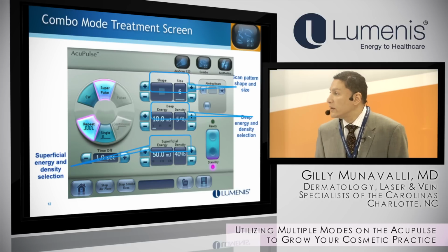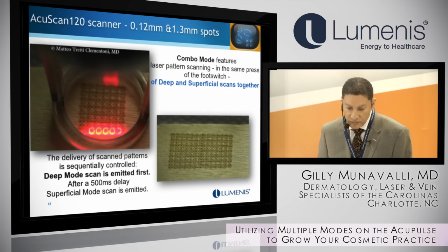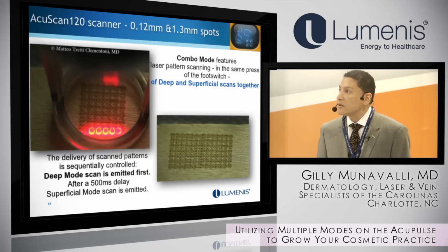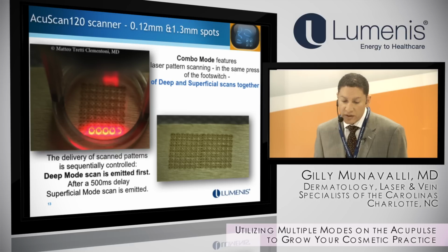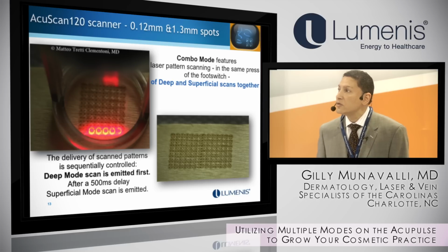Settings can be varied independently, so we'll set the deep settings potentially more aggressively depending on how deep the wrinkles are, and then the superficial settings depending on what I see in the epidermal changes. So dermal and epidermal here. I like the fact that they're simultaneous, which makes it a little bit easier for numbing purposes. Although the spot size is a little bit smaller, I find that I save about the same amount of time doing one pass instead of, say, two with the UltraPulse.